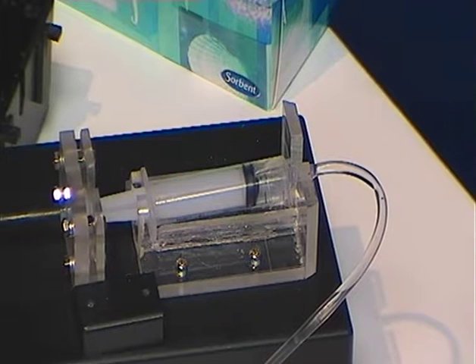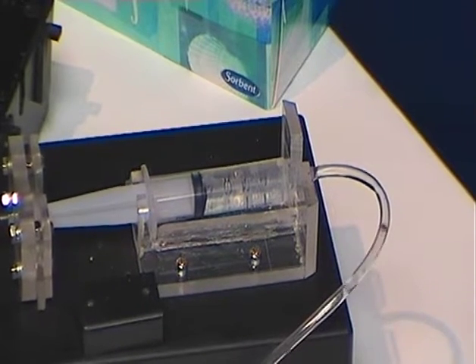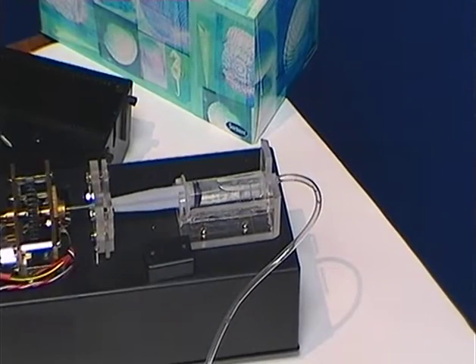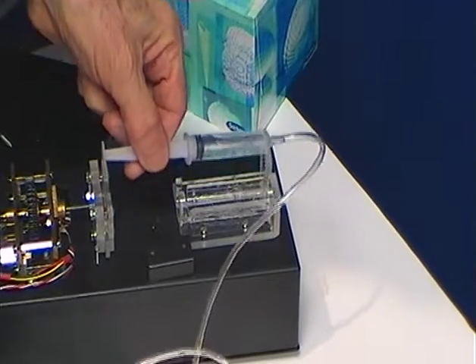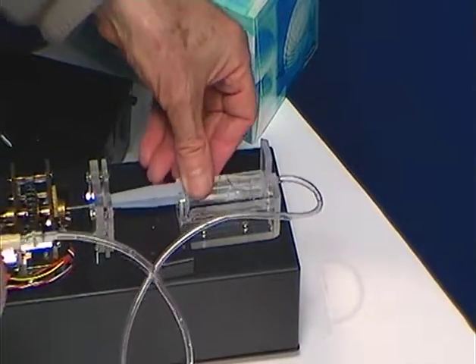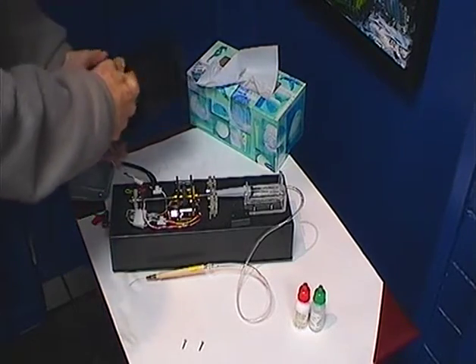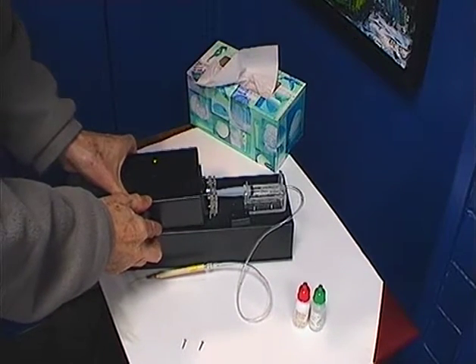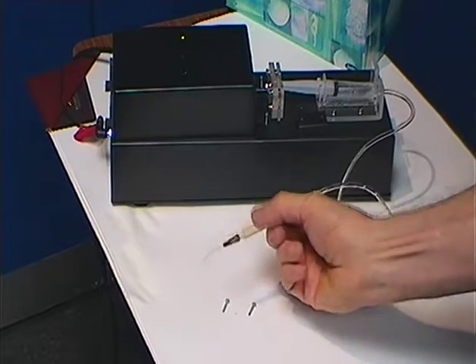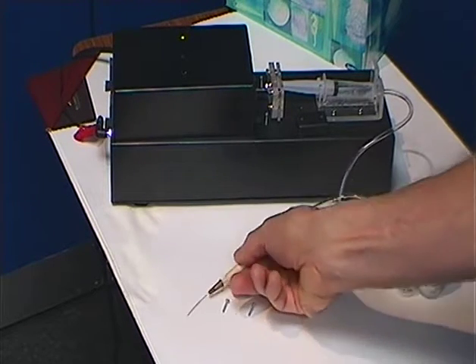When the syringe is empty, a trip switch reverses the current and the plunger device returns to the starting position. Syringe, tubing and cannula are then replaced with a new set for another patient. The tubing is from the standard IV infusion set. The drive mechanism is securely housed in a waterproof cover. I use a standard lacrimal cannula fitted to an extension handle, which I used to use for Simcoe cannulae when I first started extra caps about 20 years ago.